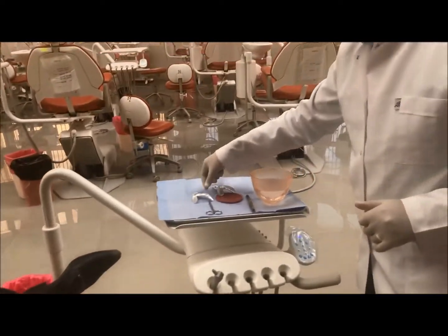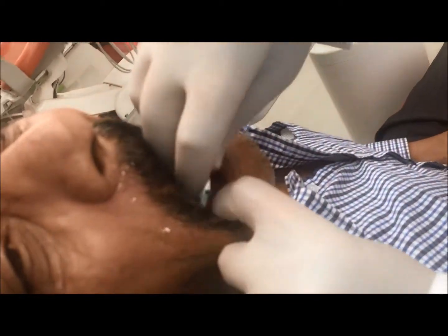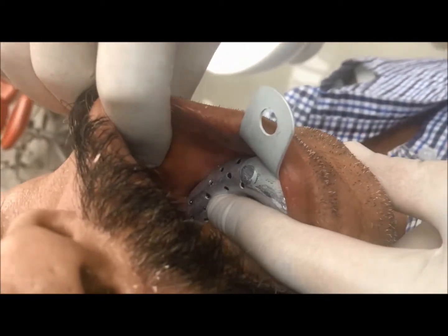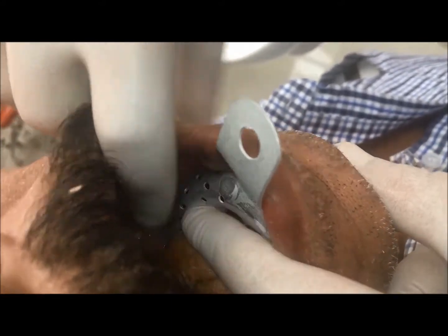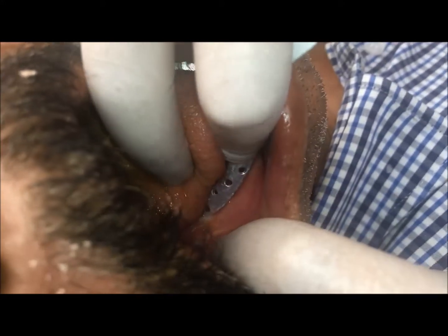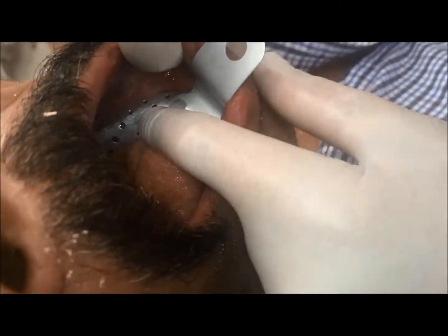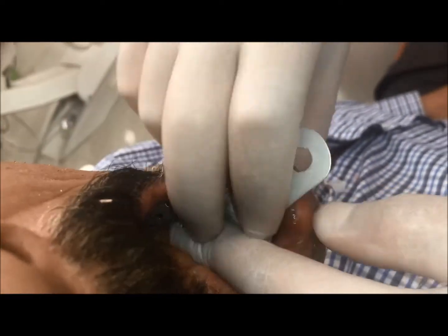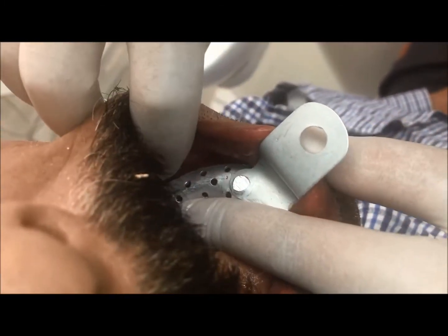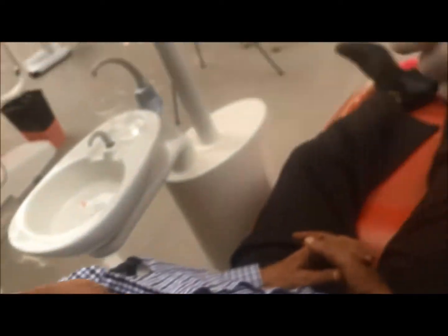I will shift to a larger tray, which is size 3. I rotate the tray, I insert the tray, and I look. The tray is covering the retromolar pad on both sides. However, if I look at the border of the tray itself, the tray is a little bit overextended at the buccal side on both sides — there is no space for the material. Thus, I have to modify the tray.